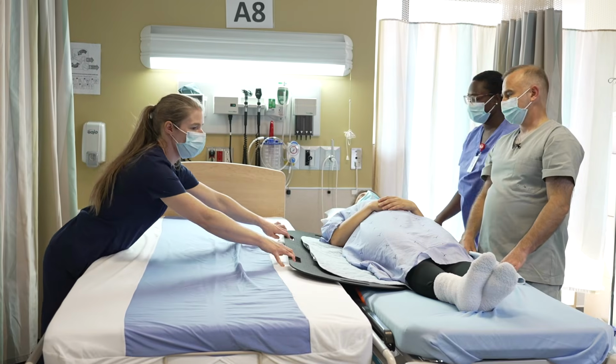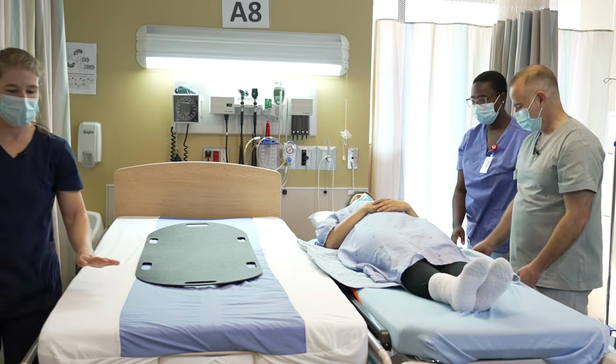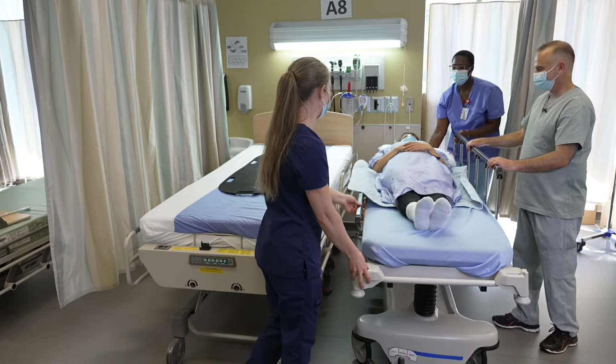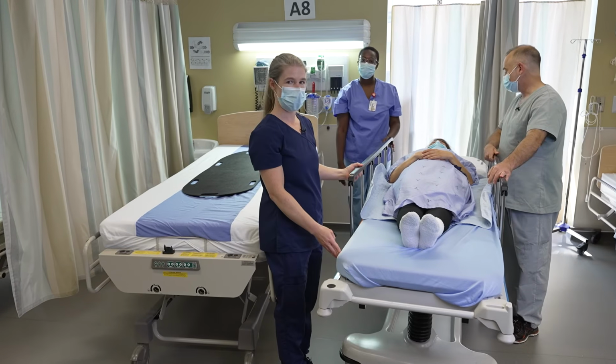So now that the patient is on the stretcher, we can actually easily remove the transfer board. We're going to move the patient away from the bed and make sure that both side rails are up on the patient for transport. Are you doing okay, Mrs. Gendron?